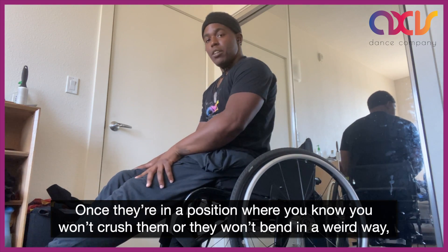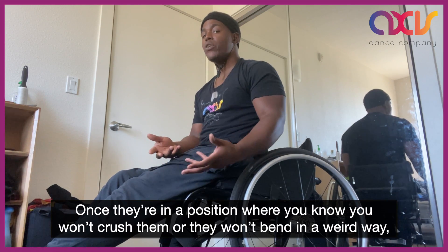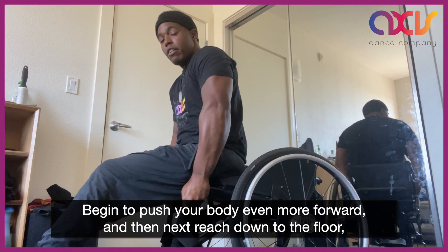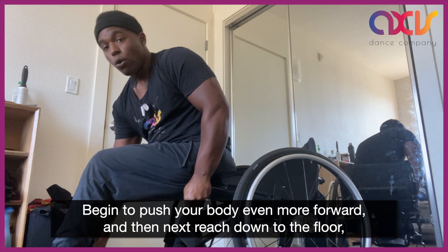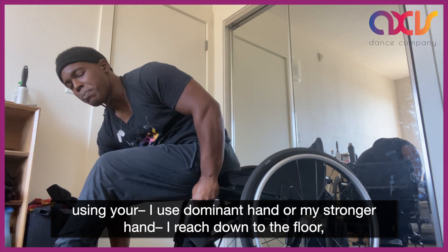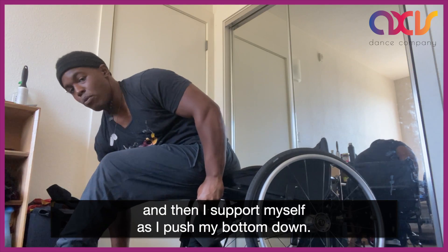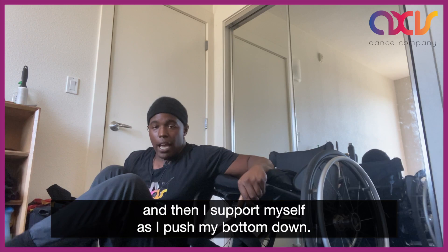Once they're in a position where you know you won't crush them or they won't bend in a weird way, begin to push your body even more forward and then reach down to the floor. I use my dominant hand or my stronger hand — I reach down to the floor and then I support myself as I push my bottom down.